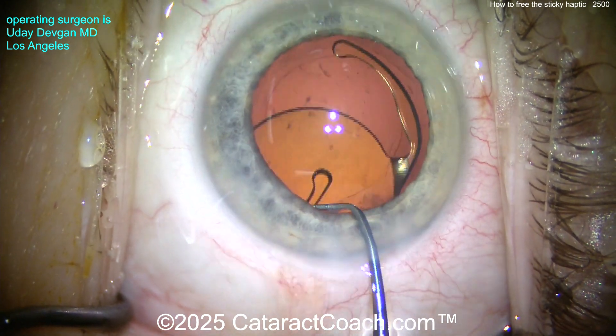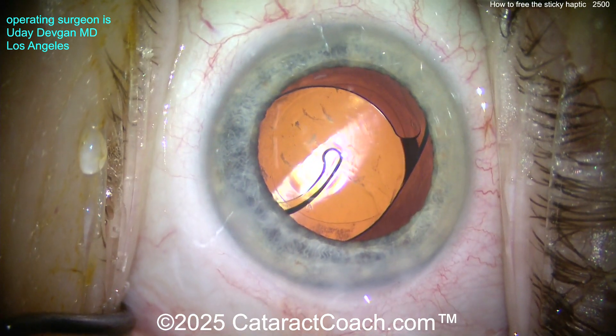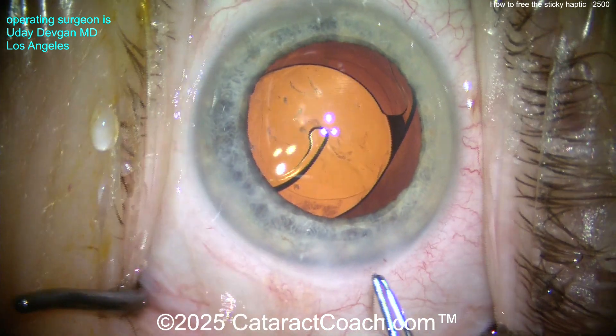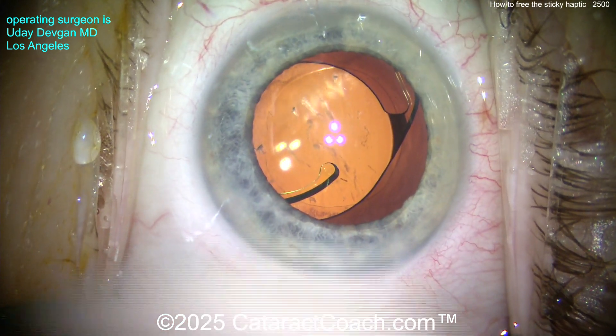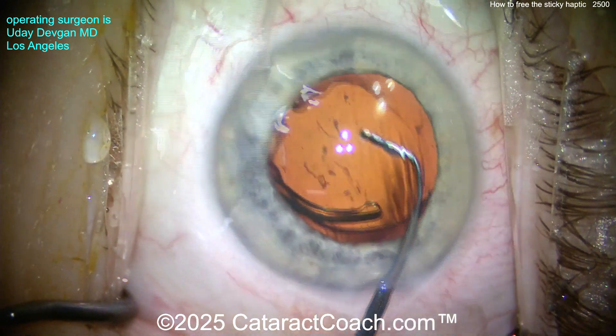So how else can you remove this stuck haptic from the optic? Here's a little trick: instead of using the chopper — because you can see it's kind of futile — get a capsulorhexis forceps and just pinch the haptic end. That'll distort it enough that when you pinch it, it releases. That's a neat little trick — please put that in your library and use it one day in the future.